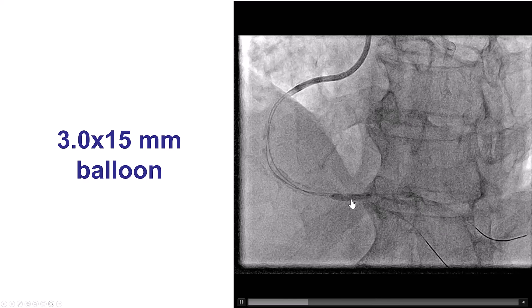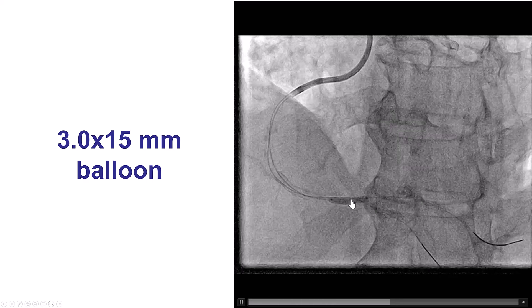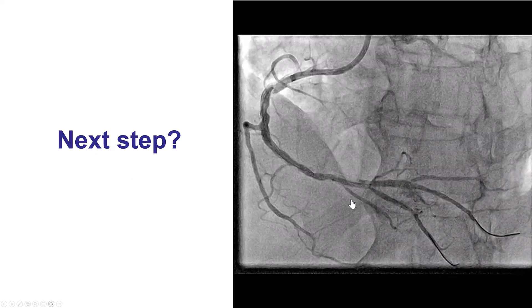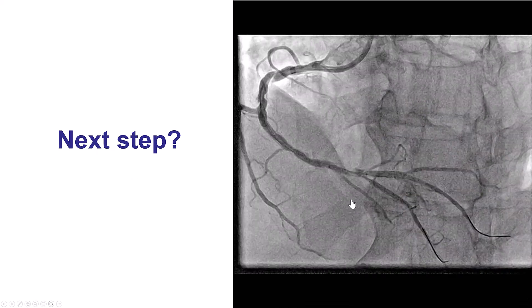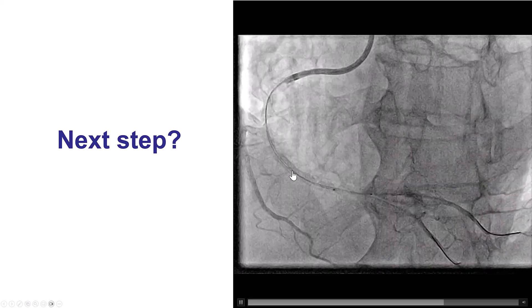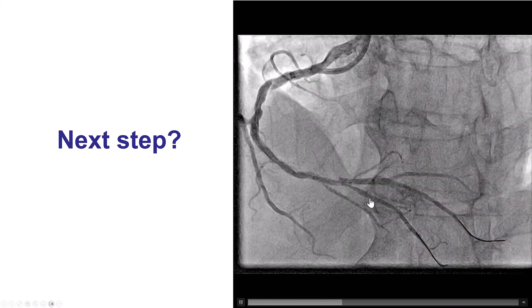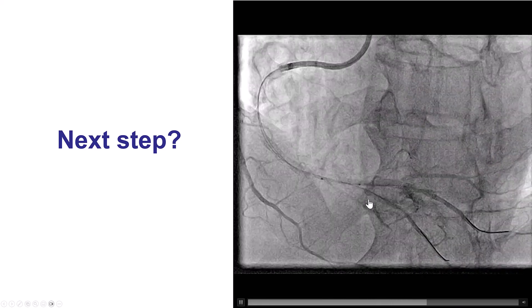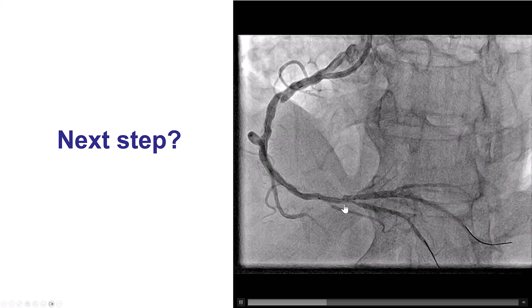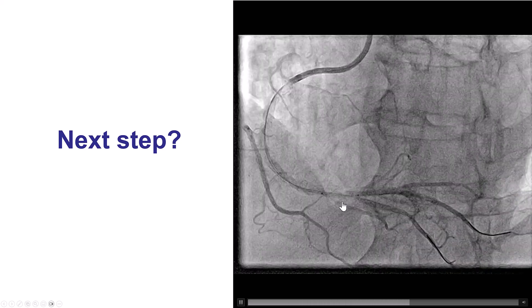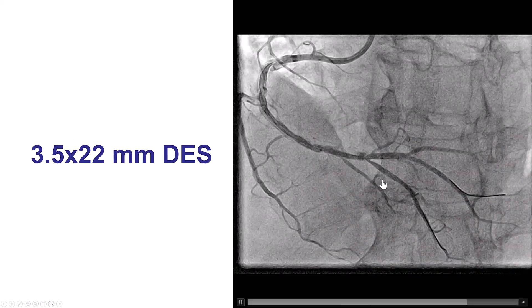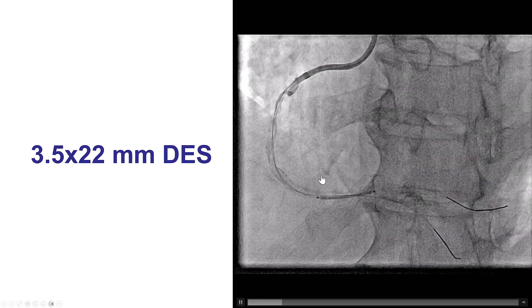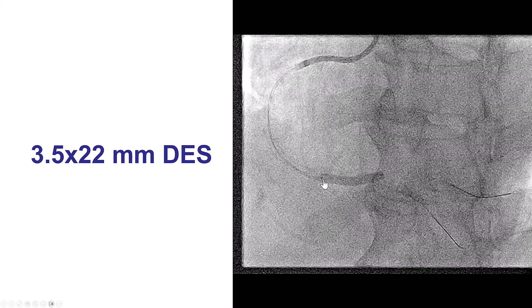We predilated the lesion and decided to proceed with provisional stenting as planned. After predilatation it looks pretty good. We don't necessarily always balloon the side branch, and here it didn't seem to have significant stenosis. So we did place a drug-eluting stent from the posterior lateral into the distal right coronary artery.